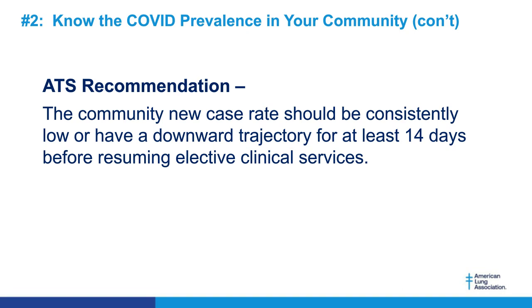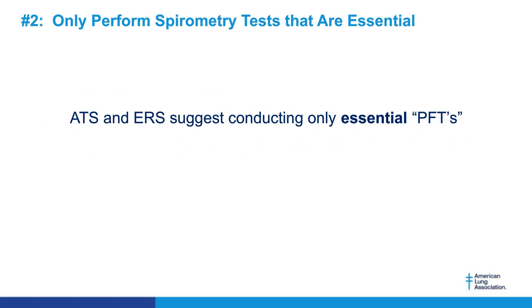My lab was designed as a negative flow room, and in all of our community here in Minnesota, I was one of the very few labs that were still open throughout the pandemic. Matter of fact, most labs are still closed. The American Thoracic Society and the European Respiratory Society are suggesting that we conduct essential PFTs only. And the American Thoracic Society gave some examples of what that is.